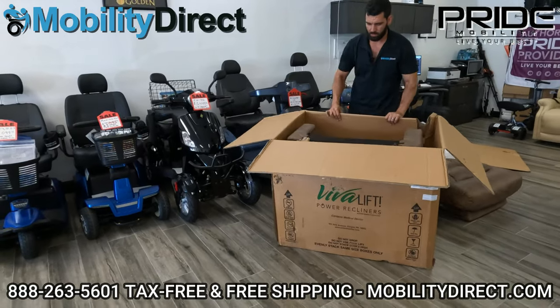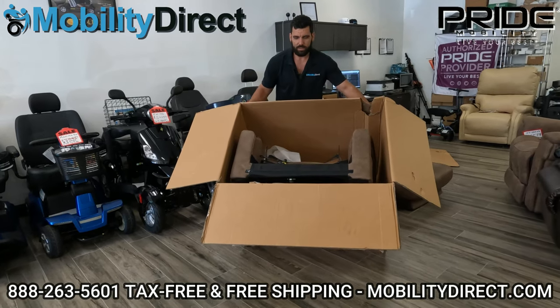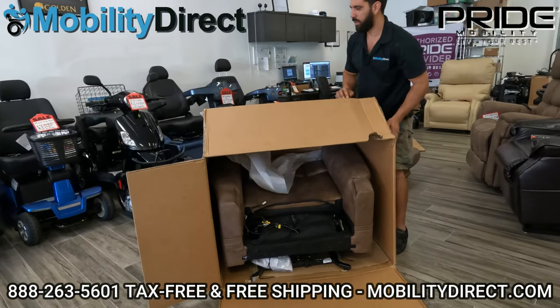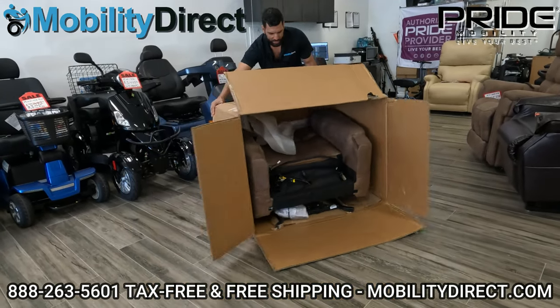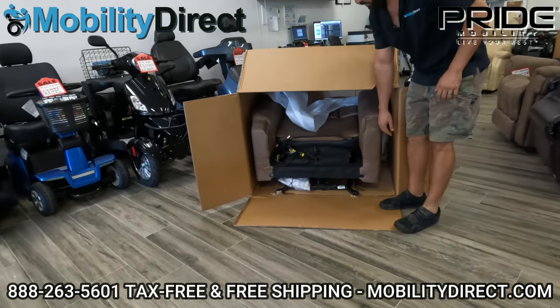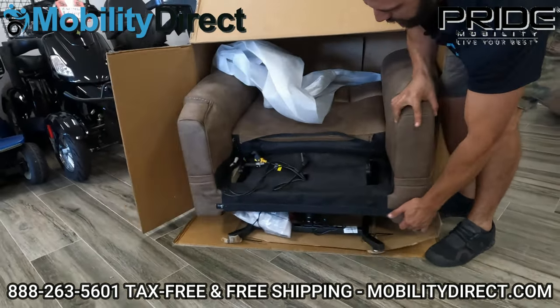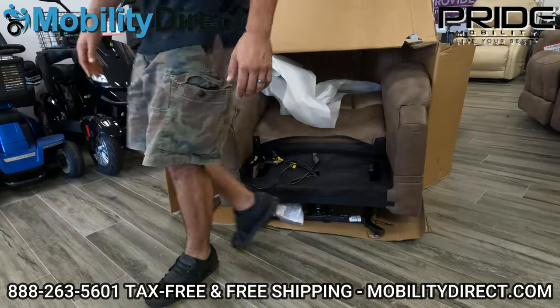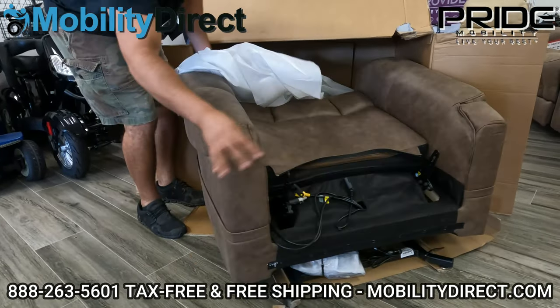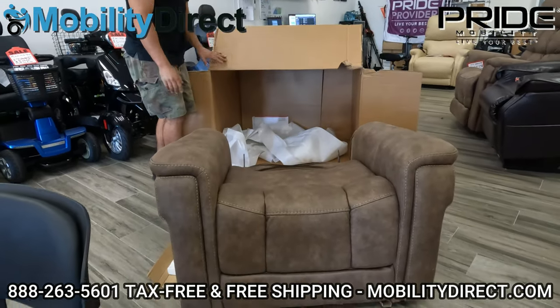I'm going to show you the trick here. If you only have one person, you want to make sure the legs are down. What I do is tilt the box forward so that the chair is on its legs. At that point, you can get it out with one person, as long as the person has the strength to shimmy it out. I put my foot on the cardboard so the box doesn't slide with me as I'm shimmying it out, and eventually it's out — just like that.